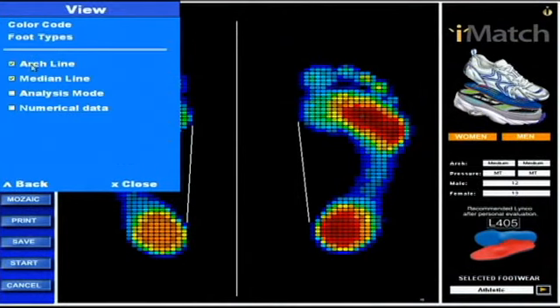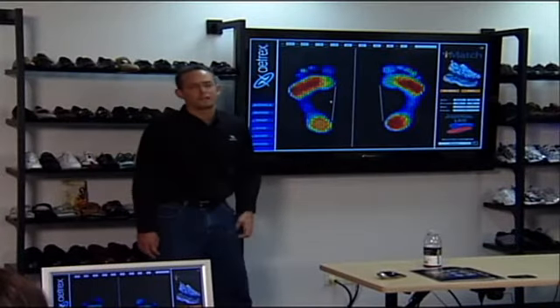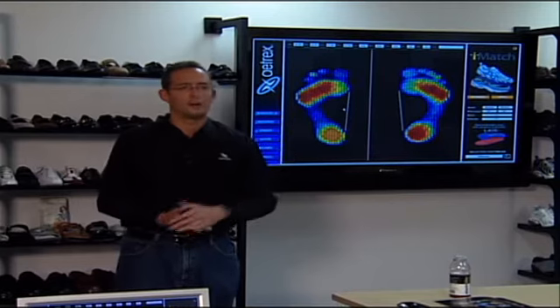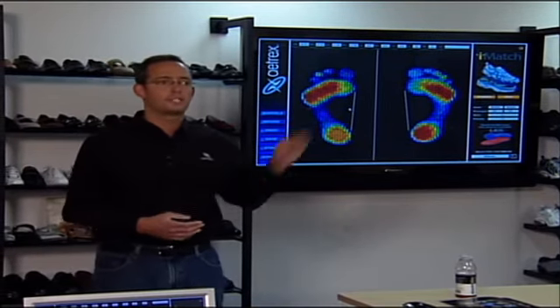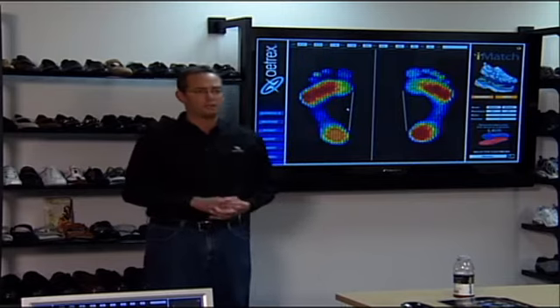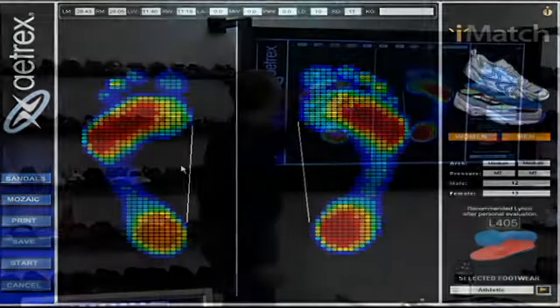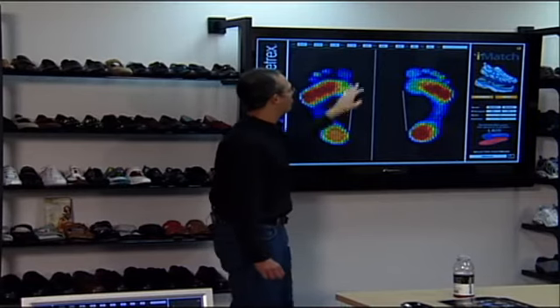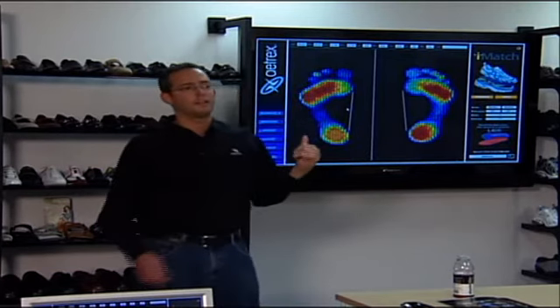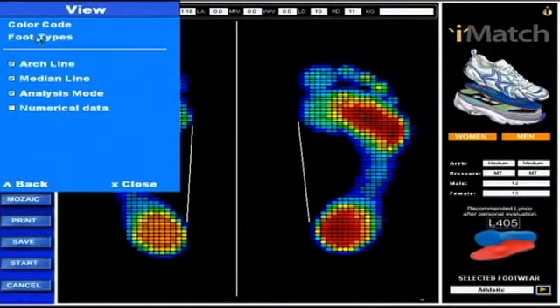Analysis mode is typically used for customer support. When somebody has an i-Step question and they call Joe's team — Joe runs our i-Step department here at HREX — they'll typically ask somebody to access the analysis mode. This brings up statistics to help see what's going on with the machine. It gives the exact millimeter measurements for the left and right foot in terms of length and width, and also shows size adjustments and arch depth. All of these will be covered in the configuration part of this training session.